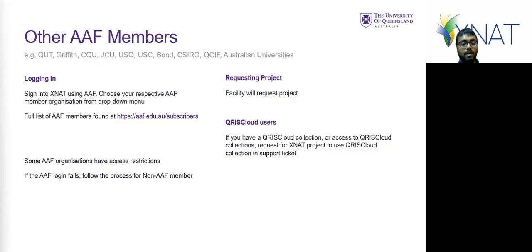When you're added to a project, you'll receive an email from XNAT, and the turnaround is a couple of days. So if you've not got project access within about 5 days, usually contact support.